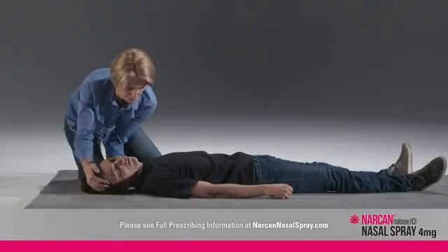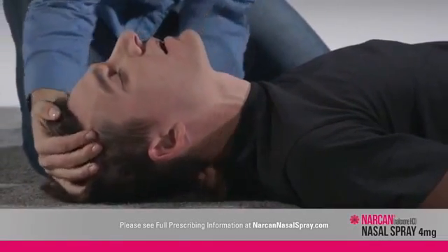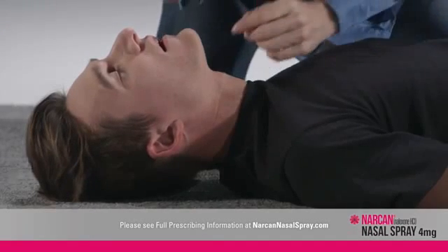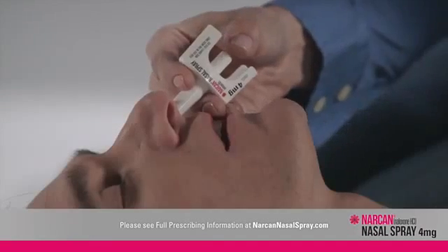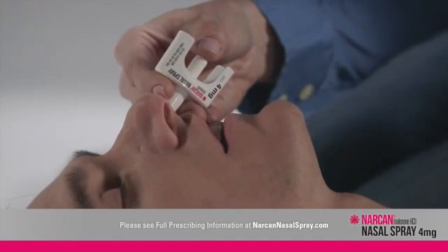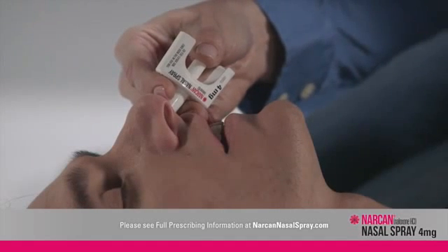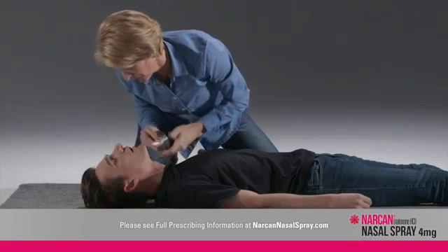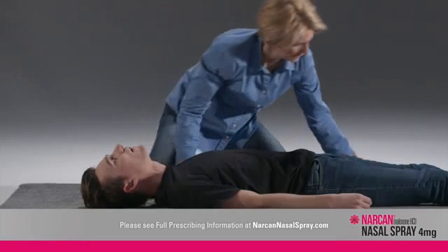Tilt the person's head back and provide support under the neck with your hand. Gently insert the tip of the nozzle into one nostril until your fingers on either side of the nozzle are against the person's nose. Press the plunger firmly to give the full dose of NARCAN nasal spray. Remove the device from the nostril after giving the dose.